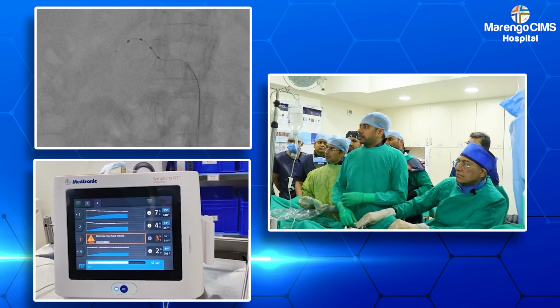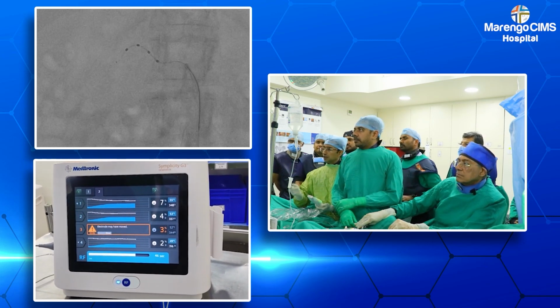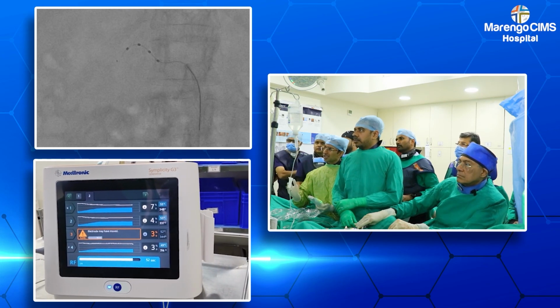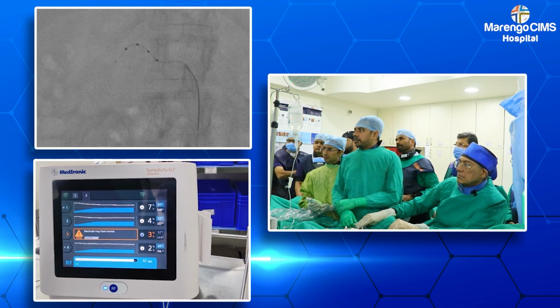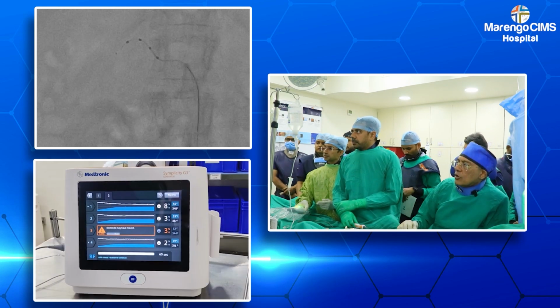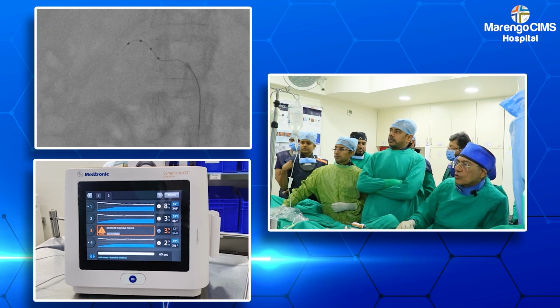So you can see the percentage rise, the depiction of it here on the screen, as well as the temperature rise on the right hand side. The resistance is more or less the same or slightly fallen. So that is the next ablation which is over now. Here we got very good ablation contact in the distal electrode.